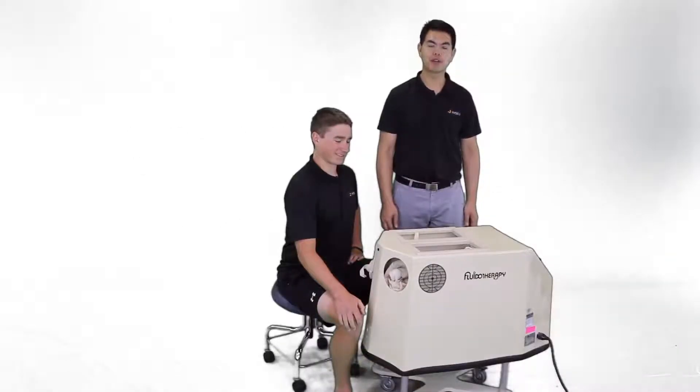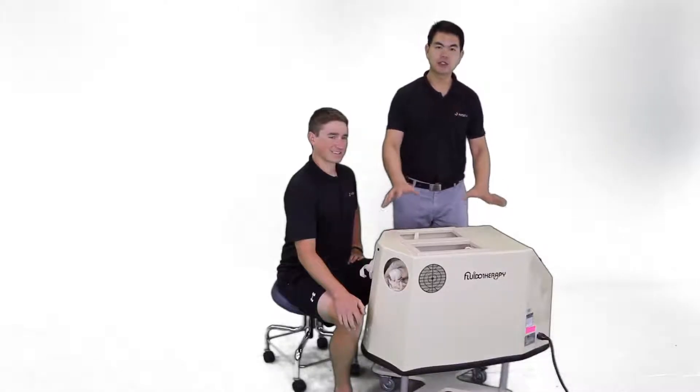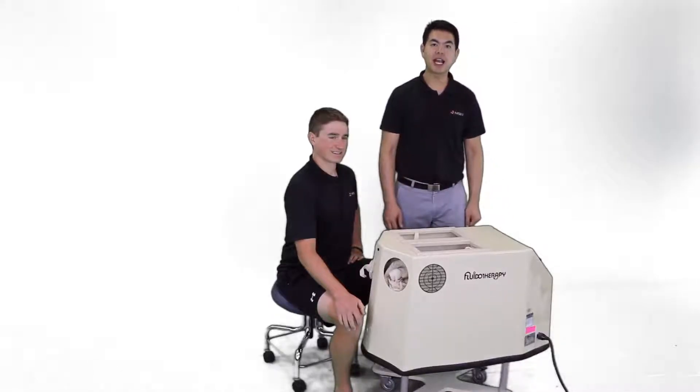Fluidotherapy is another form of thermotherapy. It is usually set up between 38 and 48 degrees Celsius, or 100 to 118 degrees Fahrenheit.